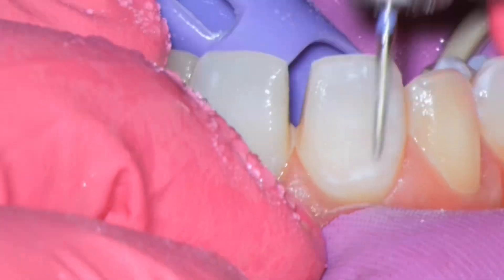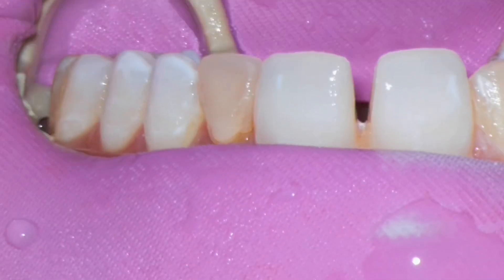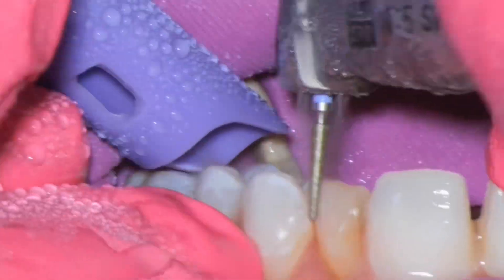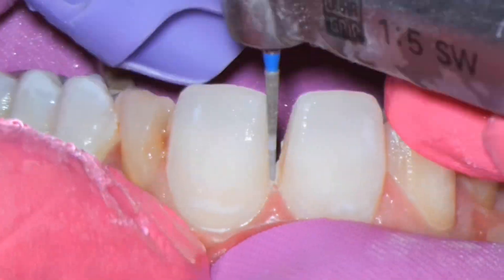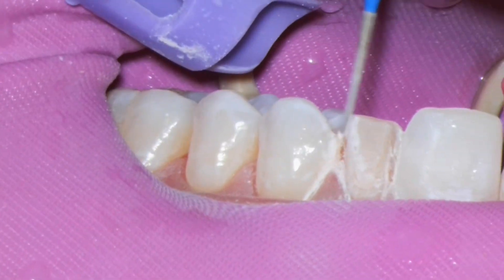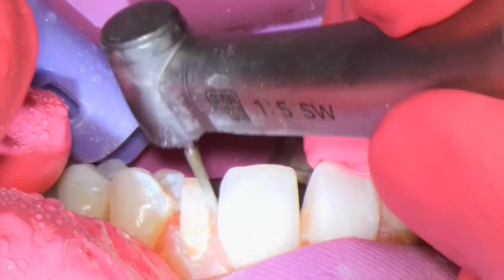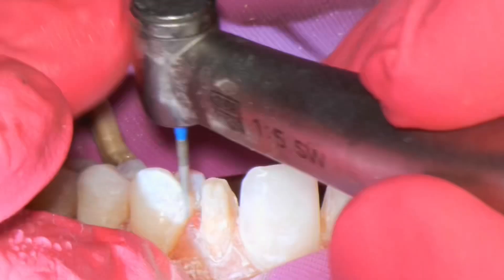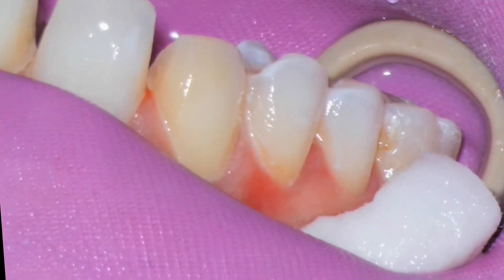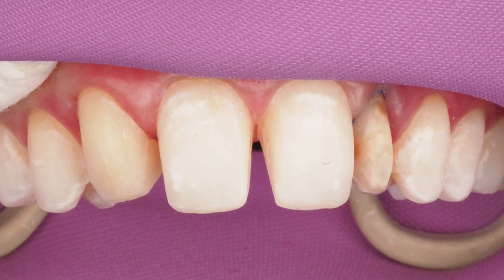I am going to prep 8 and 9 for the purposes of uprighting the midline and moving the midline, so I need to break contact on 8 and 9. Everything else is in enamel with minimum reduction. On the primary retained tooth G, I am just removing all the old resin materials that were on that tooth, cleaning up any decay, and making sure that the prep draws — breaking contact both mesially and distally and reducing the distal of 9 so that I could try to widen that primary tooth G.